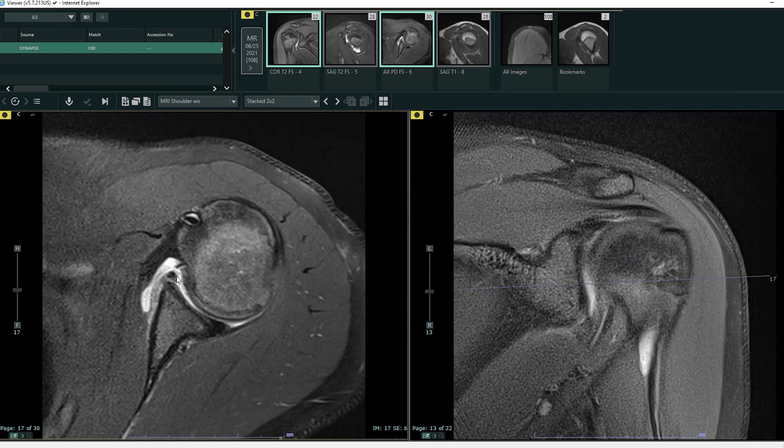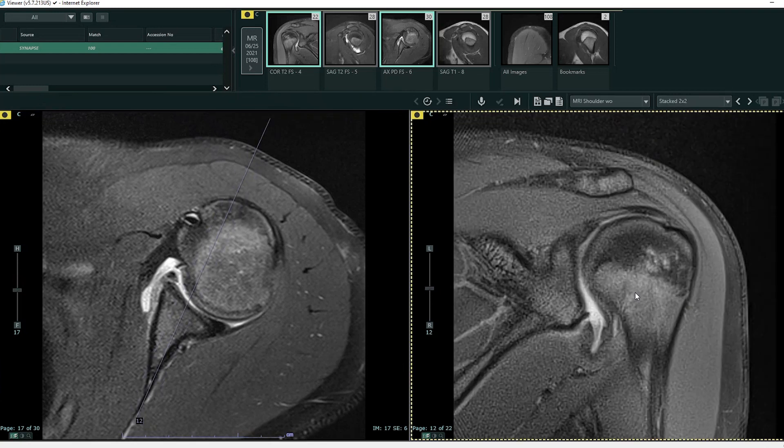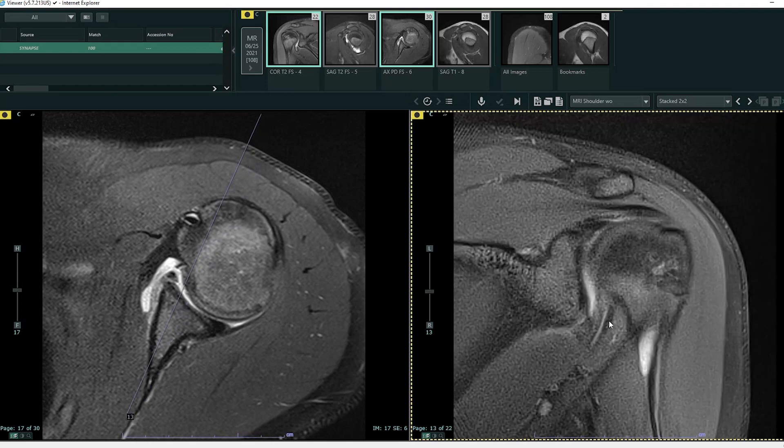The glenoid labrum is this black or darker signal structure right here, and it is torn from the glenoid. Normally you can appreciate a triangular black signal immediately against the glenoid, which helps broaden that socket — remember the ball-and-socket — to help keep the humeral head in place. Unfortunately here, this is torn. These are the common findings we see in a glenohumeral dislocation. Moving back to our coronal image, we can also see that one of the ligaments which forms the joint capsule is torn from the labrum — it's stripped here from the labrum.